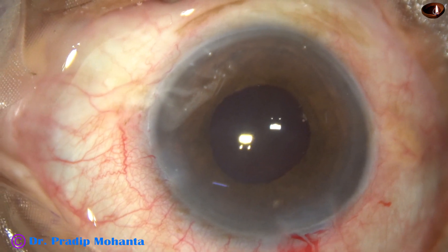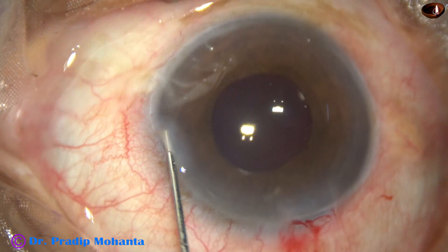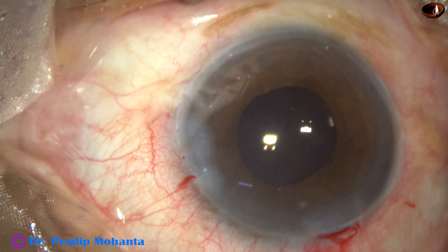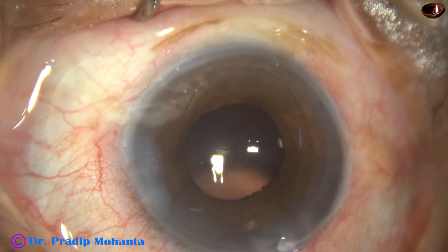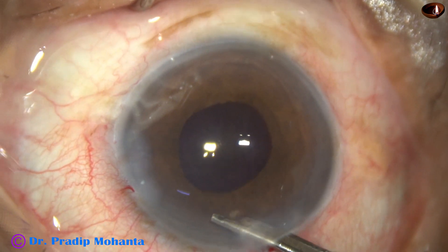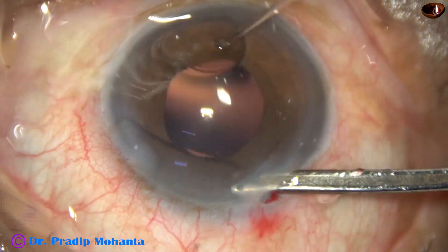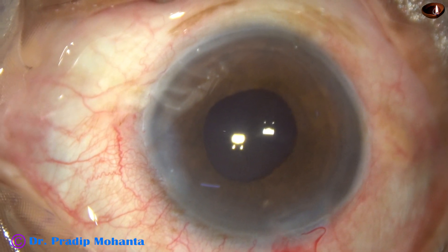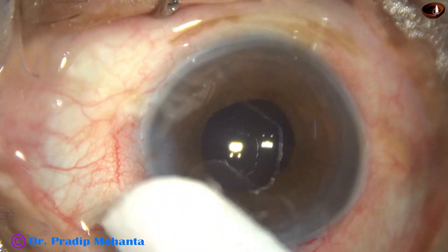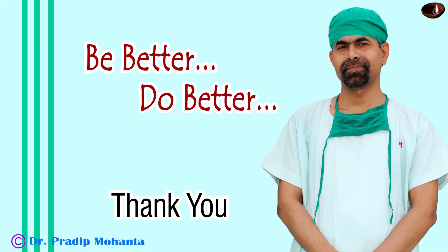Now I close the side port with a bit of moxifloxacin. I close the side port with BSS, hydrate the corneal stroma with BSS and the side port closes. A final lavage of the anterior chamber is done. The anterior chamber is nicely formed. Integrity of all wounds is checked with a cotton-tipped applicator — no leakage. A few drops of moxifloxacin is applied over the ocular surface and the case is concluded. Thank you very much for your attention. Hope this video will help you in developing your surgical skills. Be a great surgeon and serve your patients with love, respect, empathy, and great surgical competence.